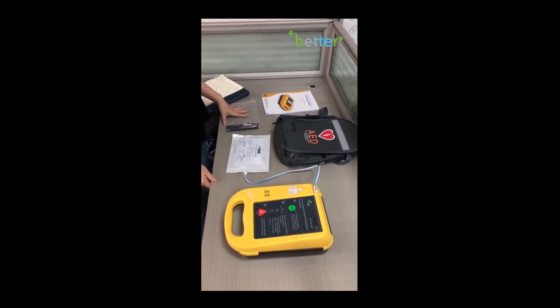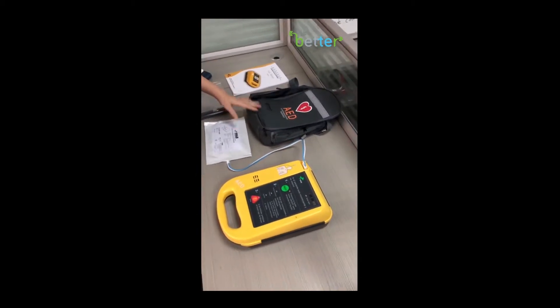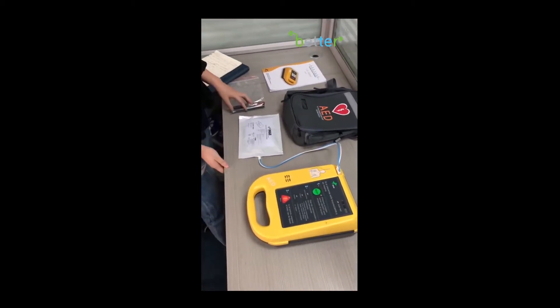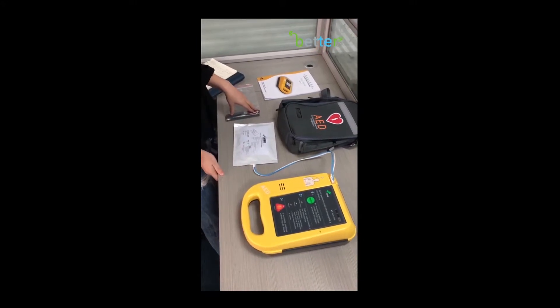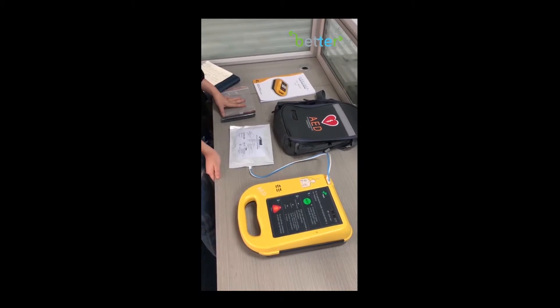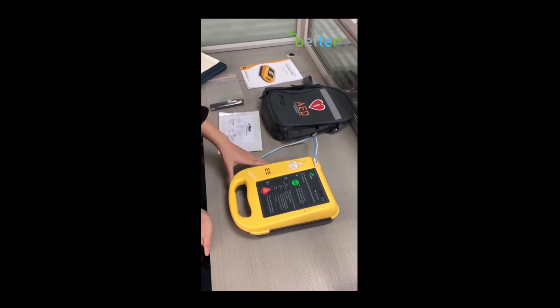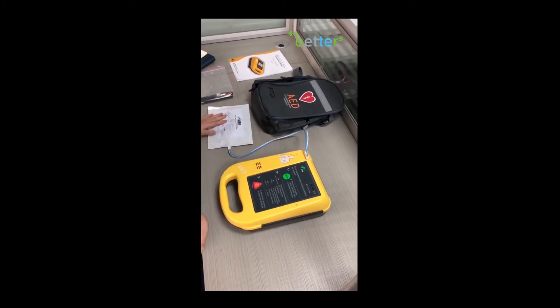First, you can see the whole set includes a user menu, portable bag, and two batteries. The M1 battery can stand by for 5 years and it's easy to change. And this is the electrodes, and this is the automatic external defibrillator.